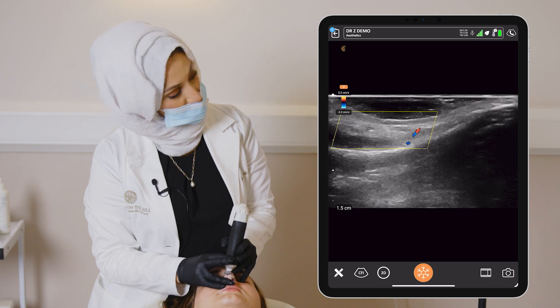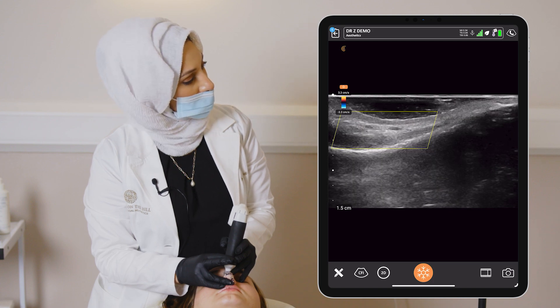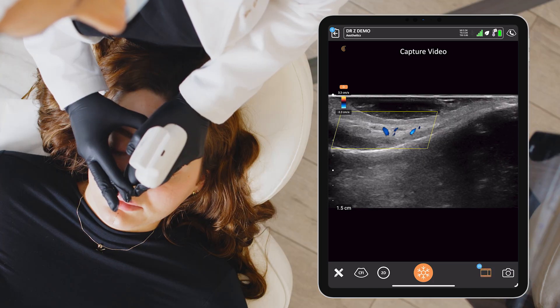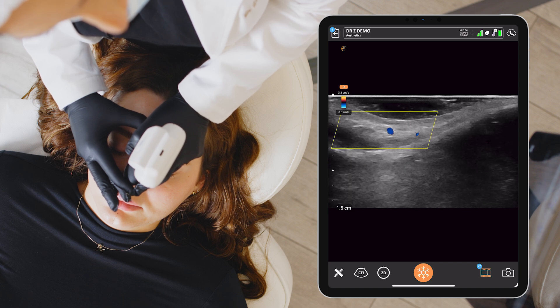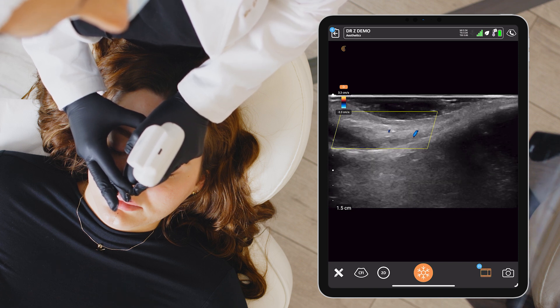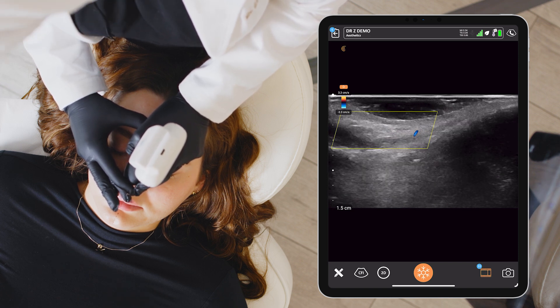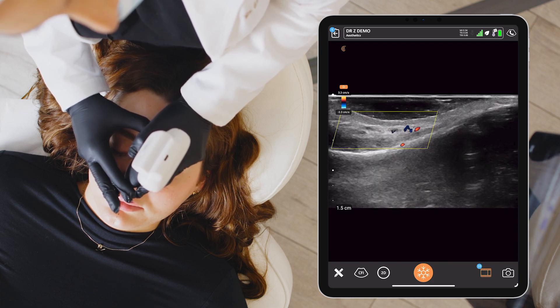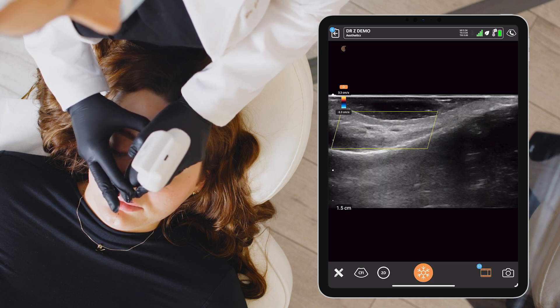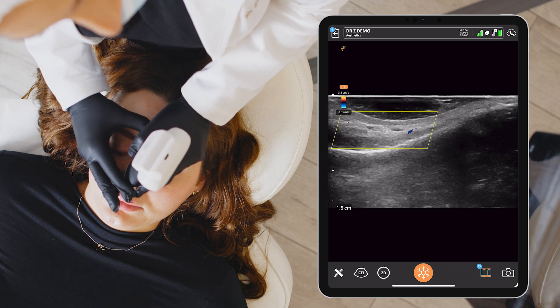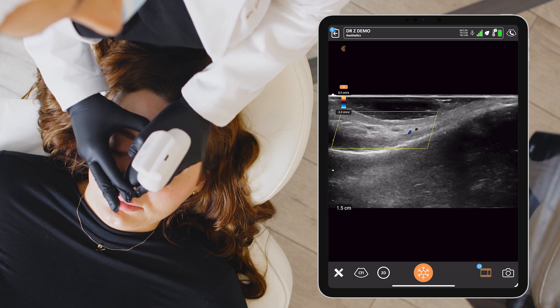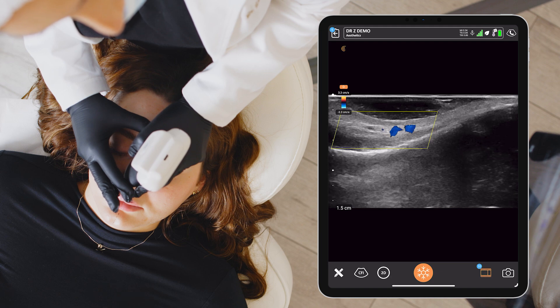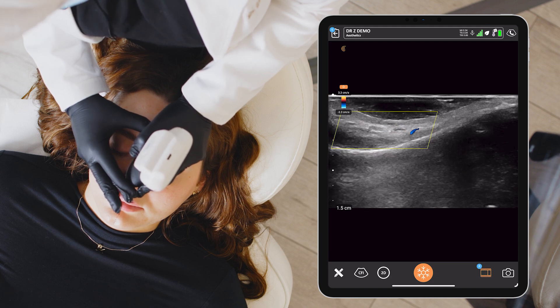I'm not sure I want to inject there. I saw a vessel just touching the bone there — so that's an area I would not recommend injecting on bone, nor can we inject subcutaneously because we also have subcutaneous vessels.